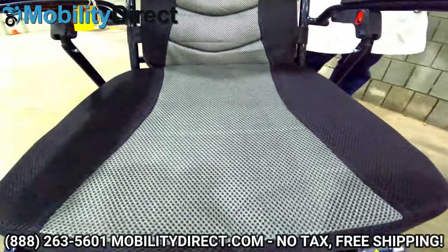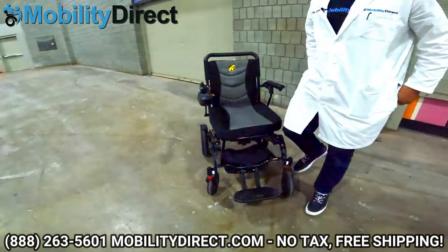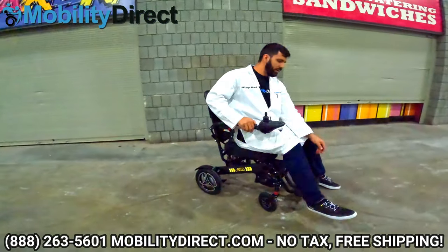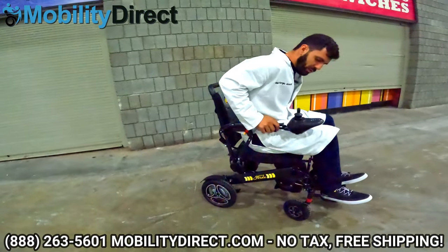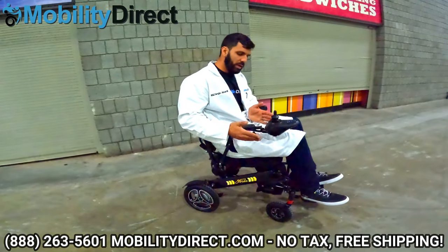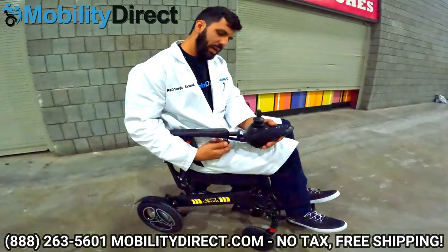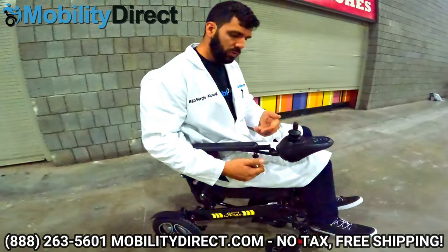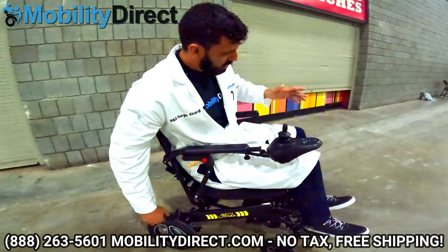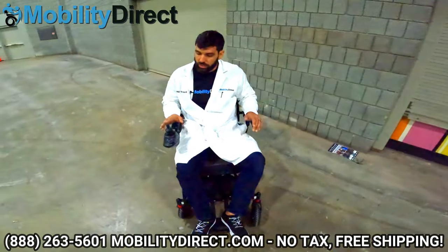I'm going to show you what it's like to ride this machine. Keep in mind I'm about 210 pounds and 5'11". What I like to do is flip up the footplate first, then put it down. You can also flip up the armrests. You can remove the joystick from the right side easily by just unscrewing the thumb screw and pulling it out — and when you detach the cable and reroute it to the left side, it's very easy to install it as a left-handed joystick setup.